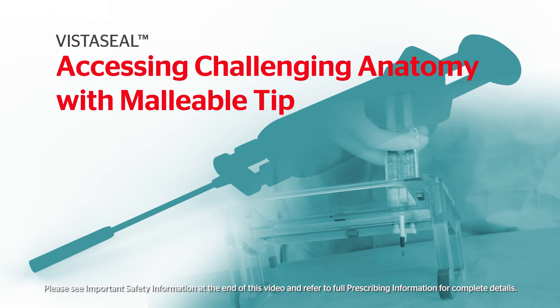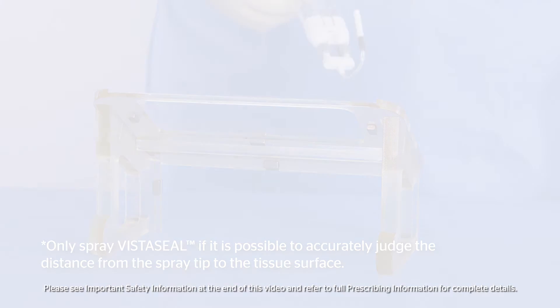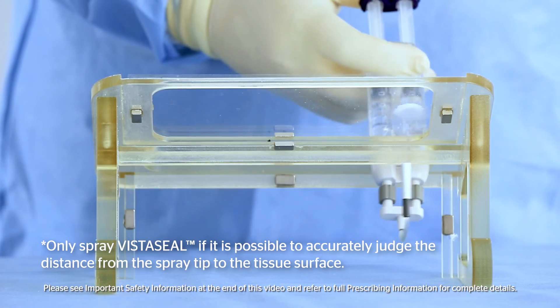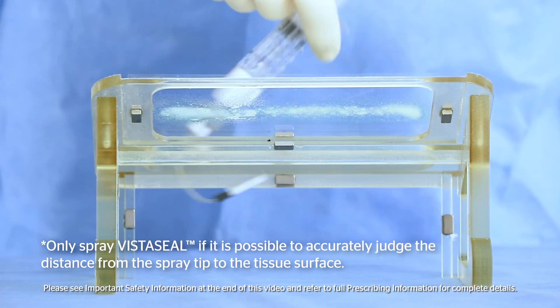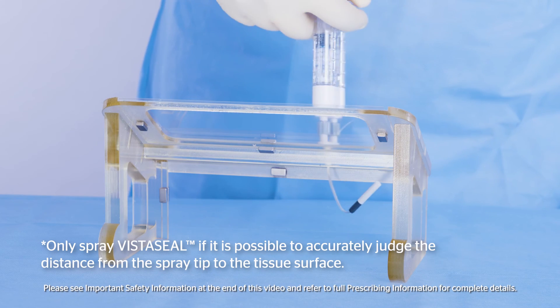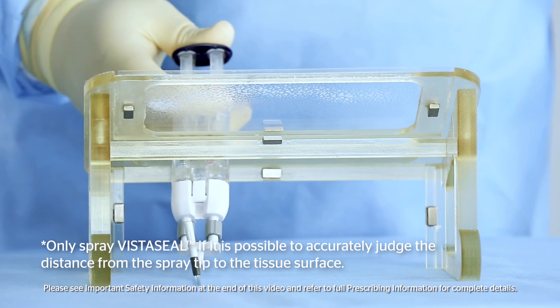The malleable tip provides precise application to challenging anatomy. This shows the malleable tip being used in a narrow spray method, as well as in a broad spray method.